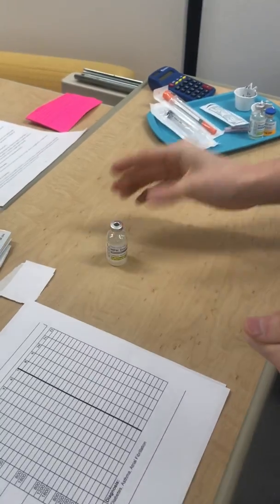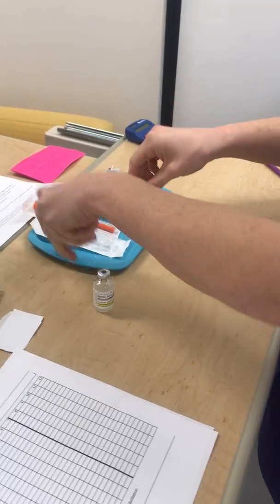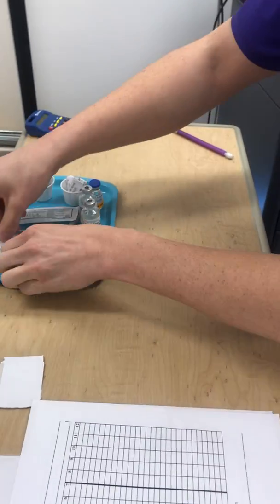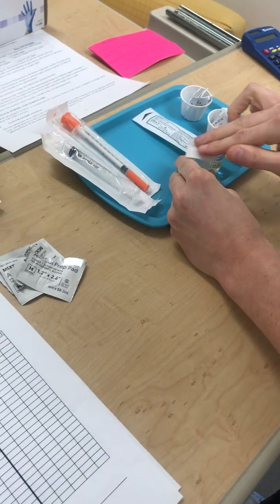Perfect. And I washed my hands before doing that. And then I'm gonna keep these on here actually. And then I'm going to clean this off. About for 20 seconds here.